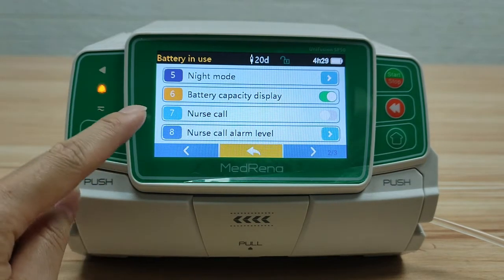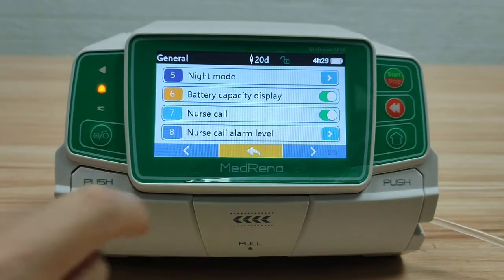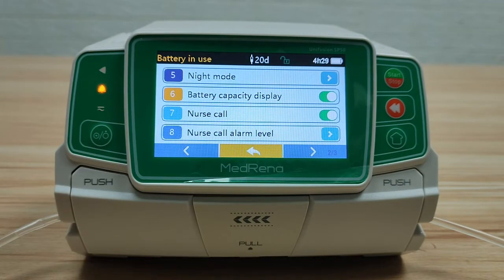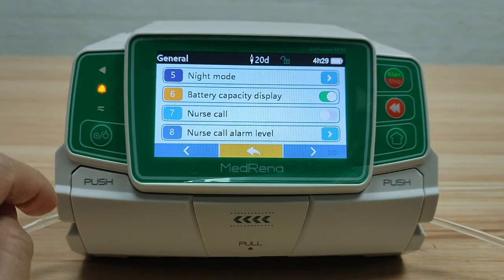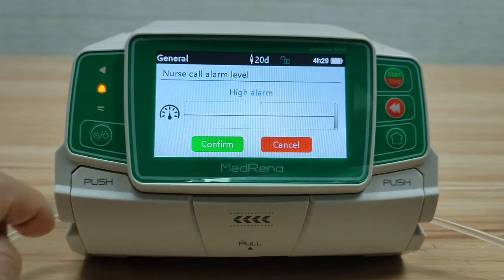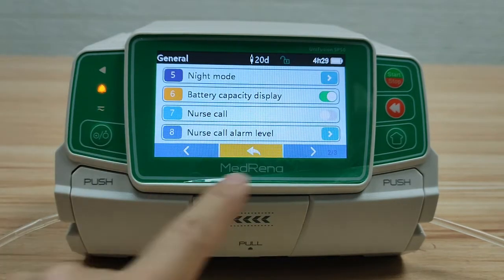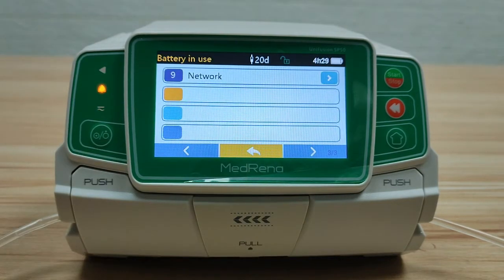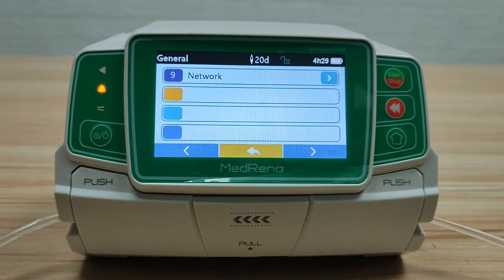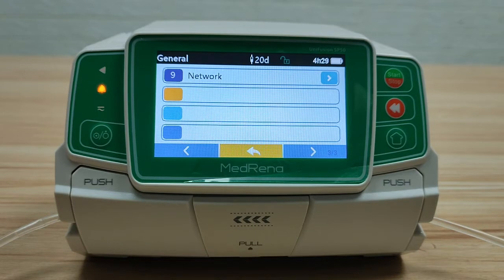The seventh item is nurse call. Turn this on when this function is needed. Nurse call alarm level: there are three alarm levels for choosing. The next item is Network — this is for setting the connection between the pump and other pumps, docking station, and infusion management system. Please contact us if detailed network connection instructions are required.